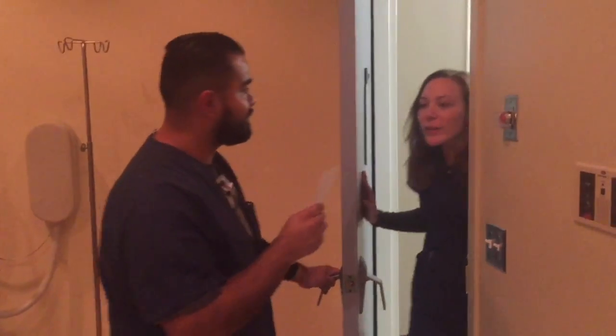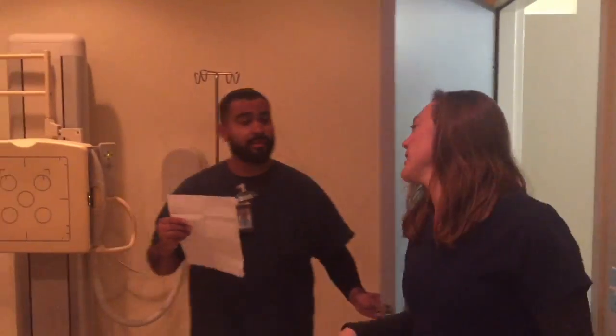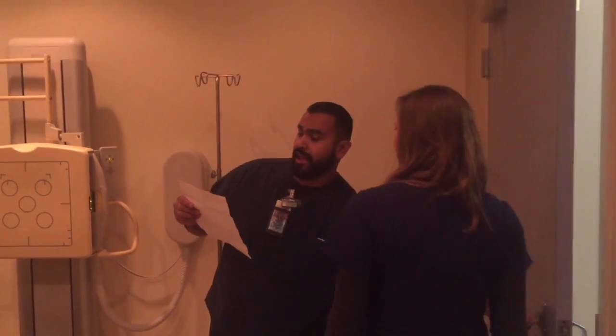Hello, Ms. Jones? Oh, yes. Hi, how are you doing? Hi, Ms. Jones. My name is Joe. I will be taking your x-rays today. But first, could I have your full name, please? It's Judith Jones. And can I have your date of birth also? Yeah, 9/28/2002. Perfect. Is there any chance of pregnancy? No. No? Okay. So what exactly happened? I was at cheerleading practice and they didn't catch me. And I fell and I hurt my head. Oh, I'm sorry to hear that.